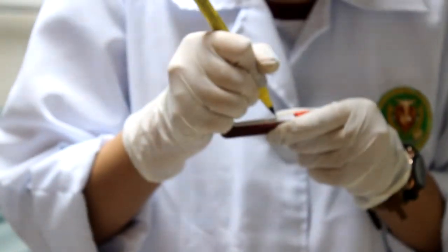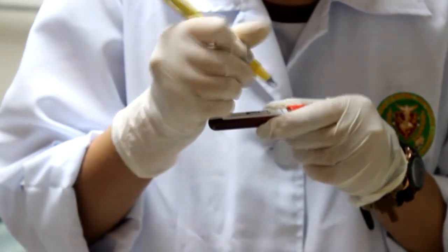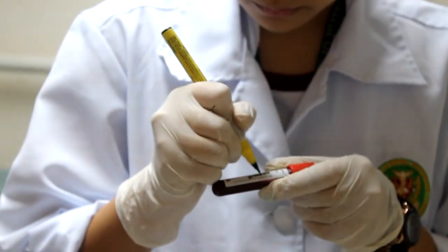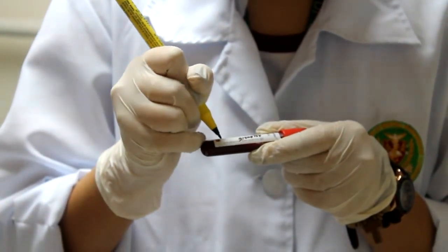Label tubes and confirm with the patient's armband or requisition. Remove gloves and wash hands with appropriate antiseptic. Thank the patient and give after-instructions when necessary.